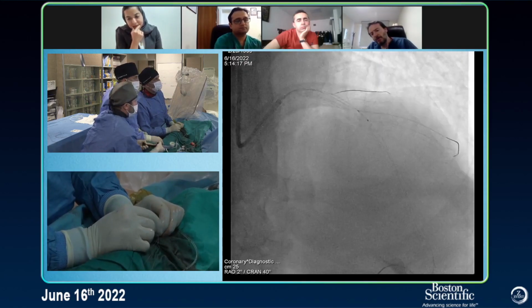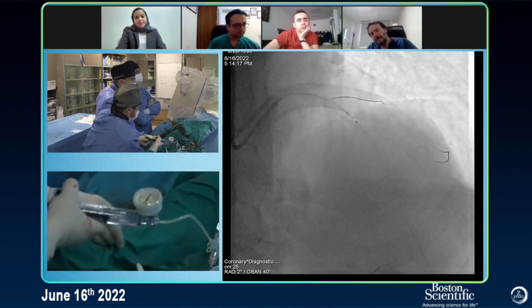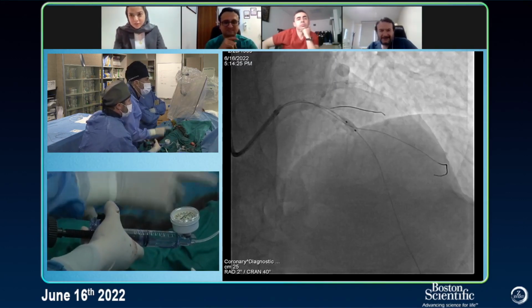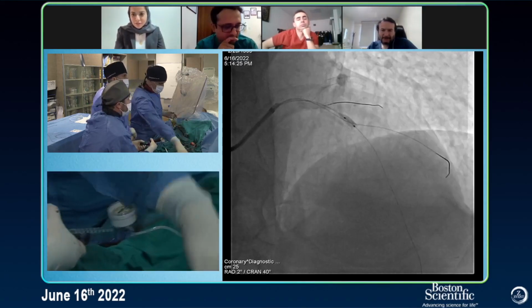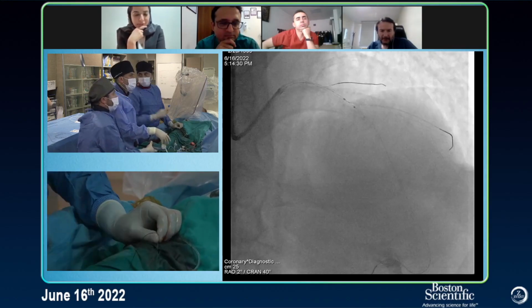Cutting the wire somehow. Do you think so? It's possible? I don't know. We will see. Now it's interesting, it looks okay. It's wide, and it wouldn't affect this. I wonder if it's okay with IVL.